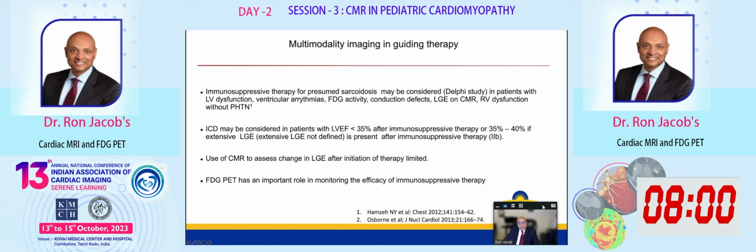Moving on, so we focused on the workup, what test to order, what the sensitivity of the tests are, how it aids in the diagnosis, how the modalities can be complementary, how they inform prognosis. What about therapy? Imaging does have a very significant role in guiding therapy as well. The Delphi study looked at immunosuppressive therapy for sarcoidosis and specifically looked at FDG activity to guide therapy.